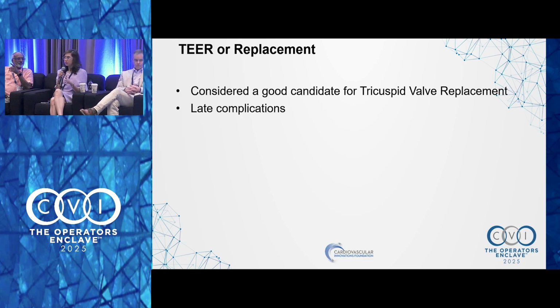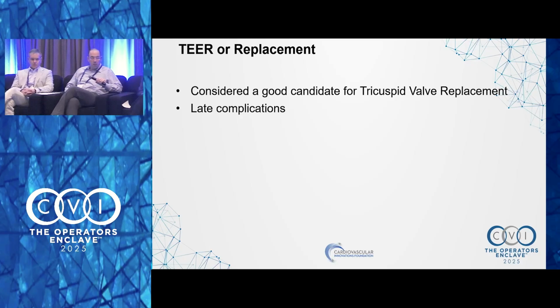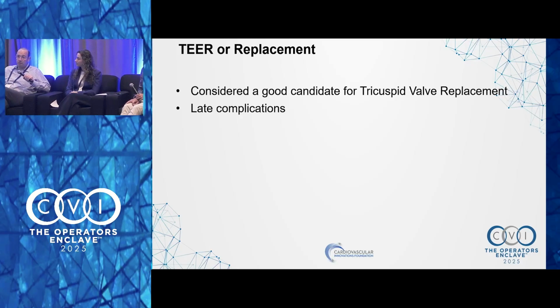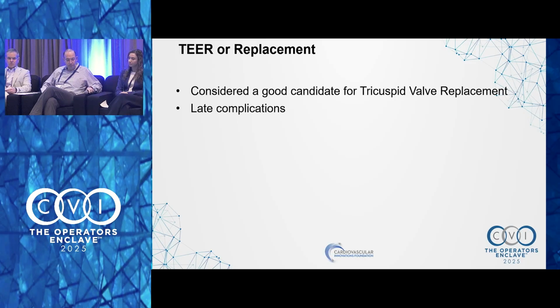What is plan B? You definitely need one, because otherwise you're kind of stuck. If this patient becomes ineligible for repair and you can't replace, then unfortunately there are poor options. Also, you always assume that the interaction is at the level of the leaflet. Many times, it's the subvalvular apparatus. Right, exactly. Okay, great. So that's what we did.